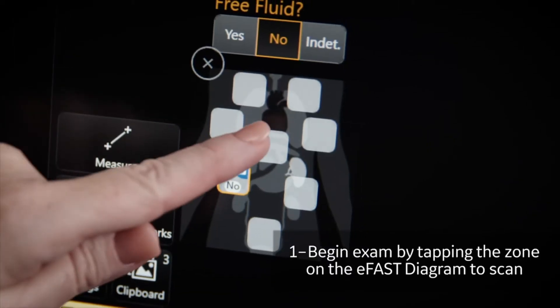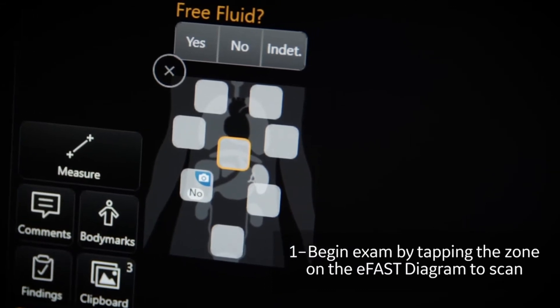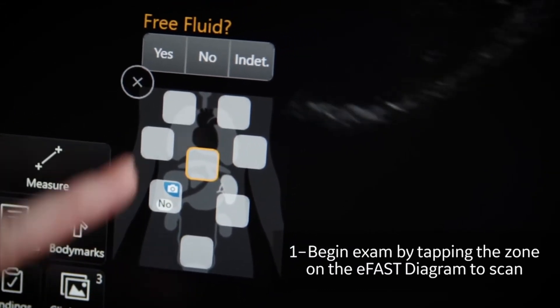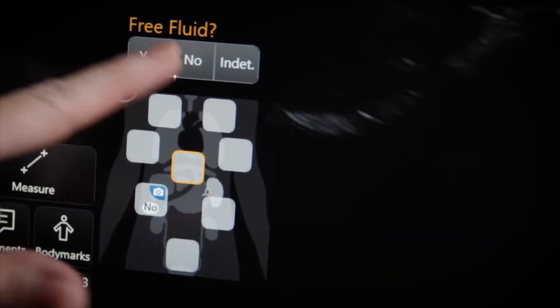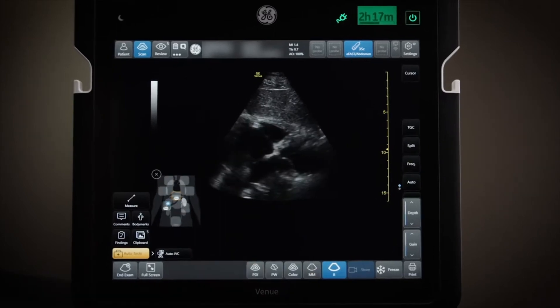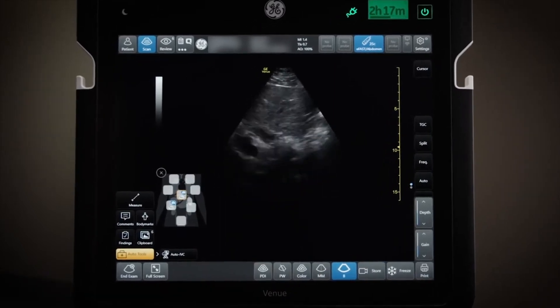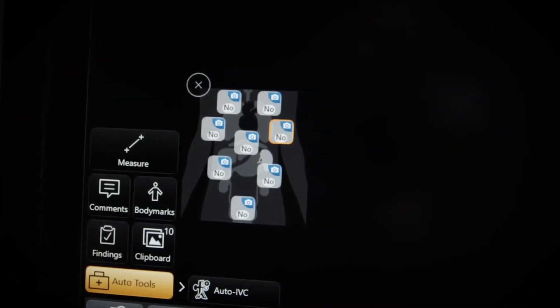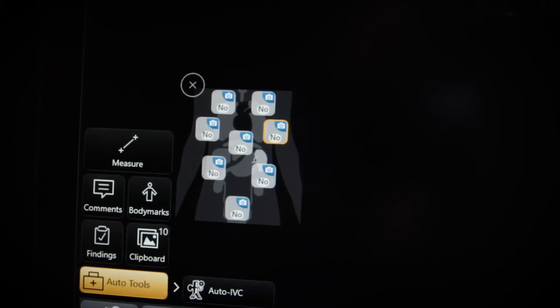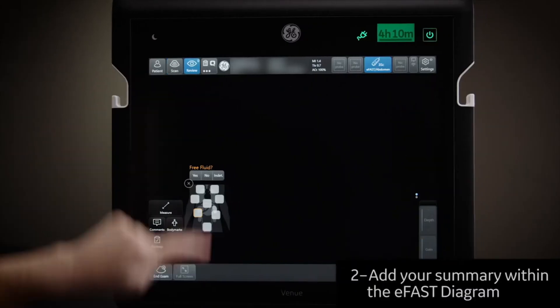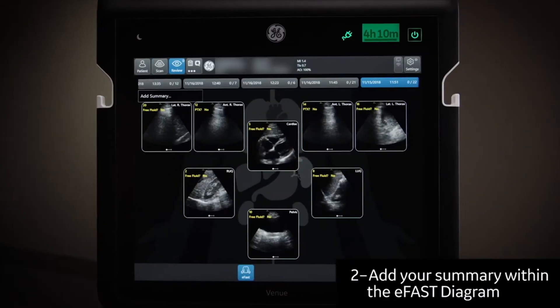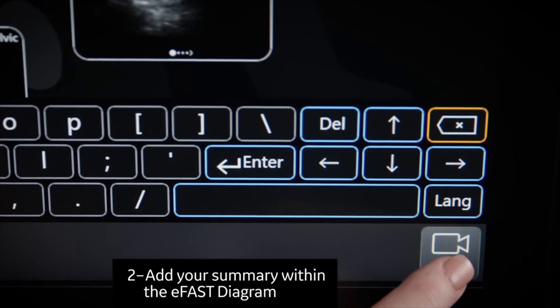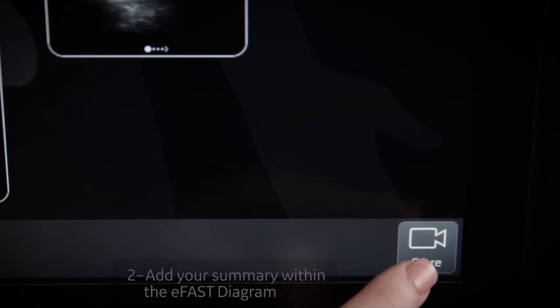Simply tap the zone on the diagram where you want to scan. In the zone view, select the pre-populated findings available and click store to save. Review all zones on the anatomical diagram to ensure you've assessed each one. When the exam is complete, add your summary and store your assessment to the patient's medical exam.